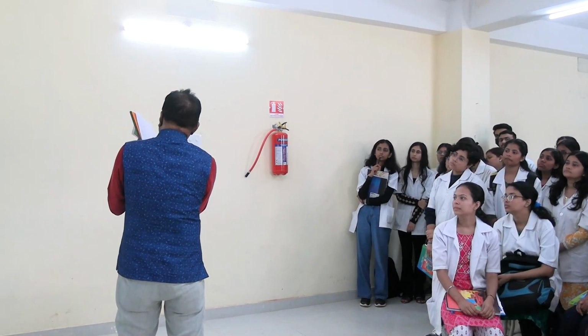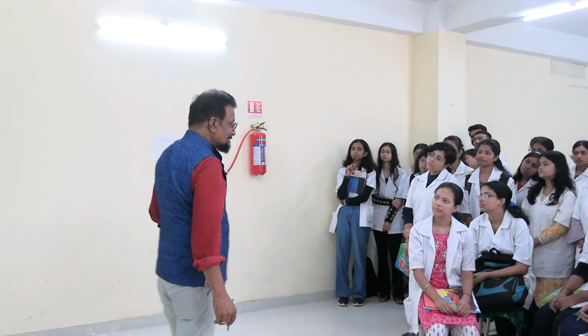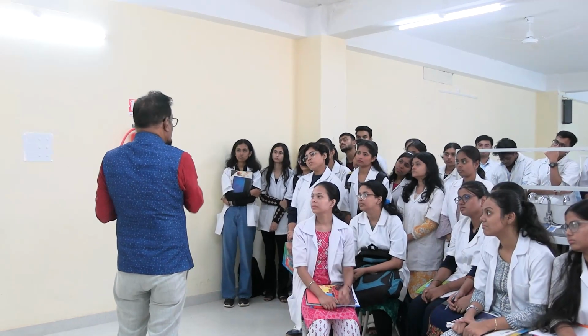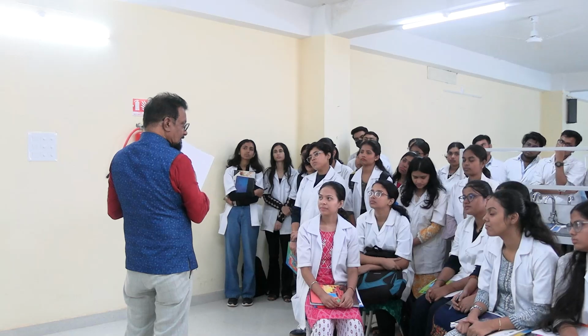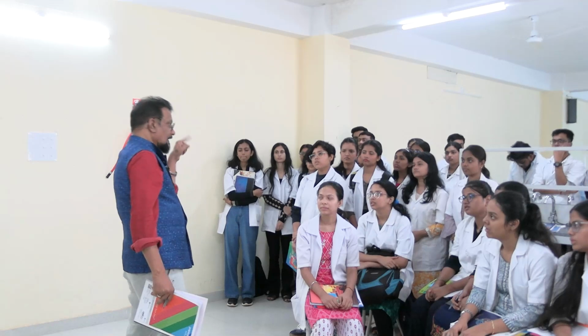Now we can join this. Out of these numbers, the percentage of different lobe neutrophils is called the Arneth index.